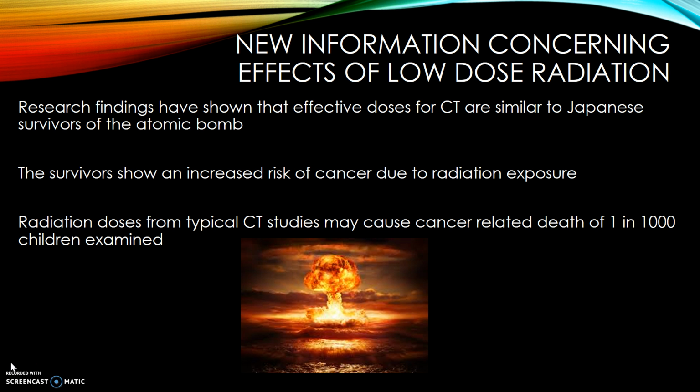Research findings have shown that effective doses for CT are similar to those of Japanese survivors of the atomic bomb. The survivors show an increased risk of cancer due to radiation exposure. Radiation doses from typical CT studies may cause cancer-related death in 1 in 1,000 children examined.